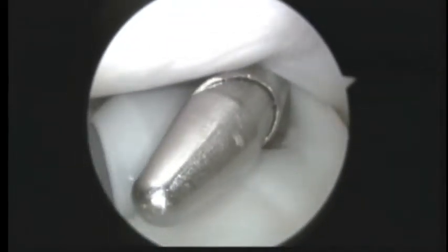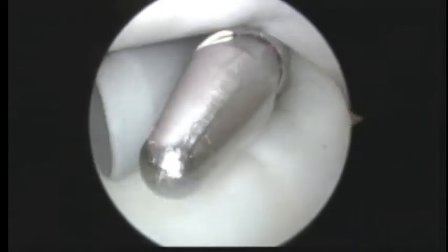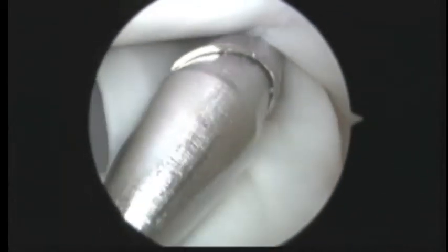Hi Dylan, it's Dr. B here with Mitzi. We're just getting started on the left shoulder. We're looking in from the back to the front. Everything's magnified 30 or 40 times on the screen.